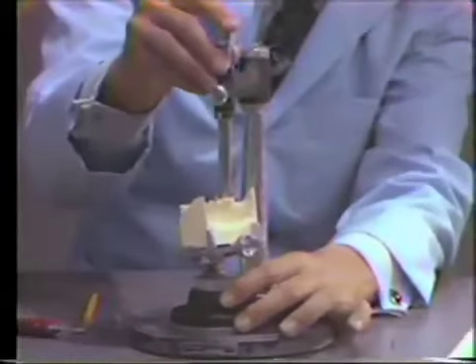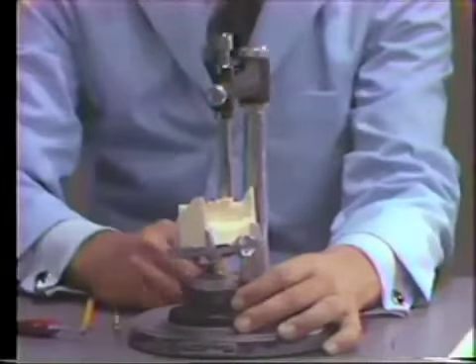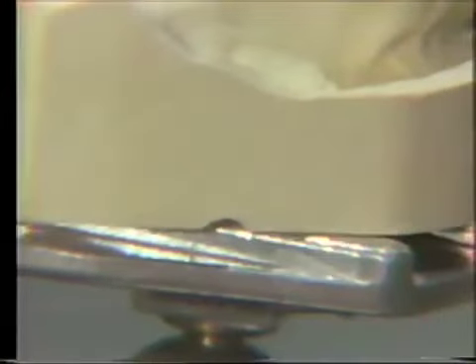Now one other plane we'll have to choose in order to determine this position. We'll have to have a marking in another plane, and we'll mark that on the side of the base of the diagnostic cast. Again, we etch it in. We don't just draw a line with a pencil, because that line may abrade off. And again, I'll just mark it with a pencil for visibility. Now I have that position.